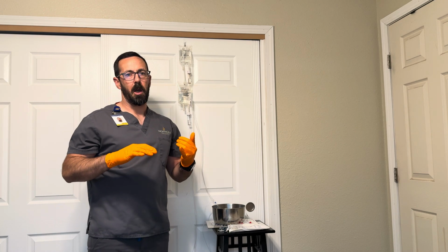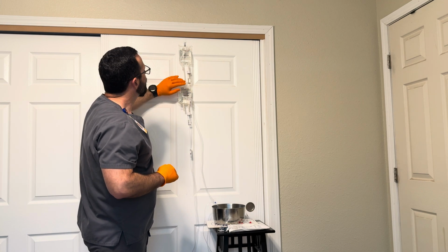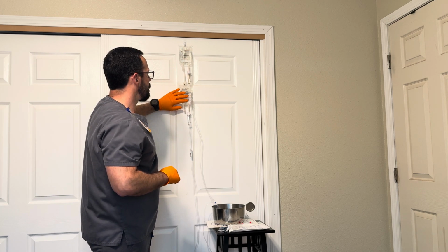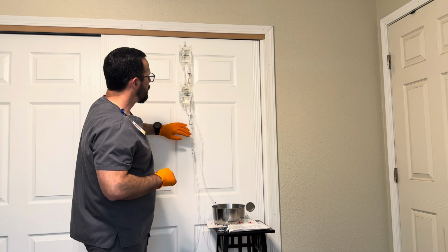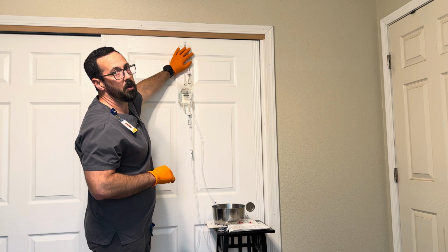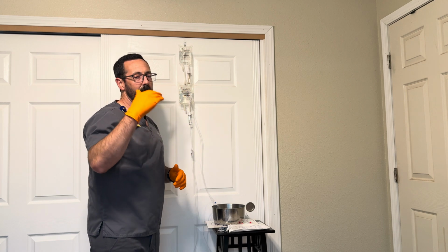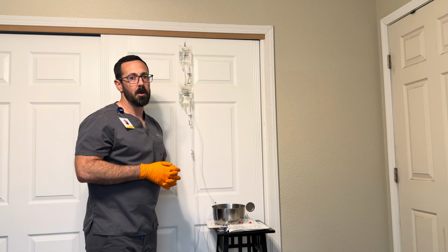So that's how we would add a piggyback to IV fluids. Piggyback rate again is 100 drops per minute, and our sodium chloride or IV bag, normal saline, is at 38 drops a minute. Being higher, or piggyback being higher, normal saline below, and again, above our patient at 30 inches or greater for an adult. Thank you.